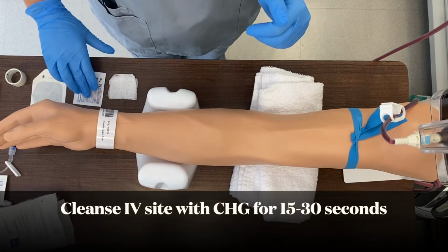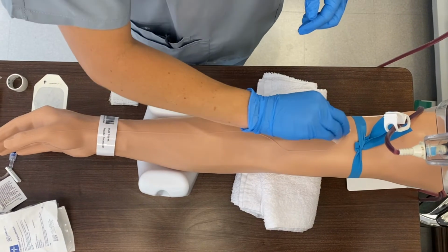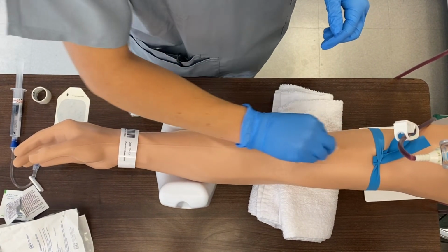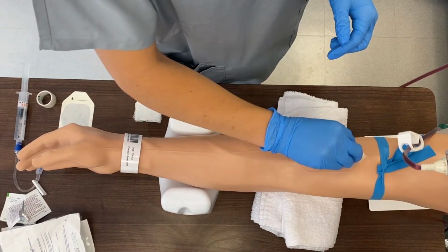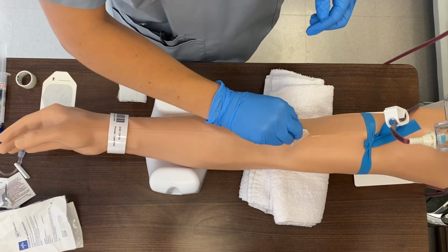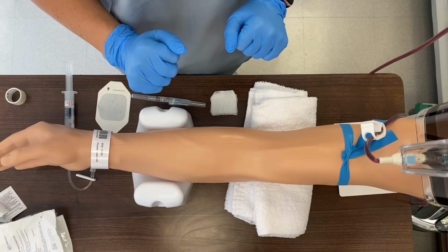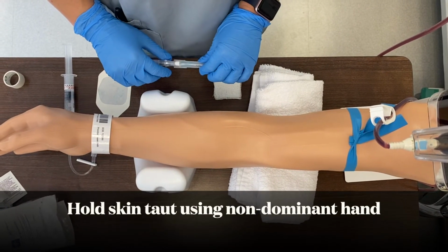Cleanse IV insertion site with chlorhexidine using a back and forth motion for 15 to 30 seconds. Allow to dry for 15 to 30 seconds. Do not wipe or blot. Hold the skin taut against the vein using non-dominant hand without touching the prepared site.